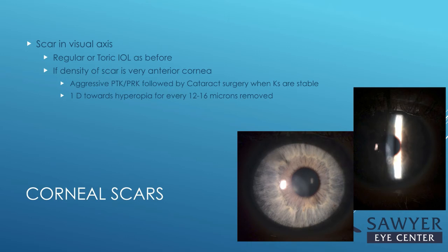But also remember, if you're going to consider this, this is not a great idea if HSV is the reason for the scar, because your PTK or PRK can actually activate the virus again, and you might end up worse off than where you started.